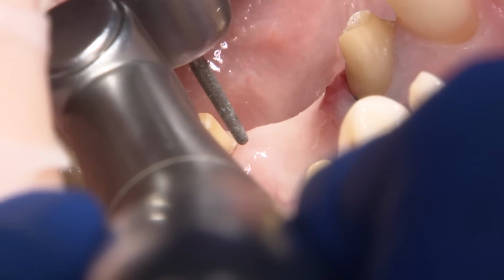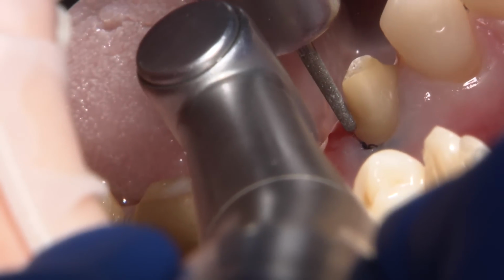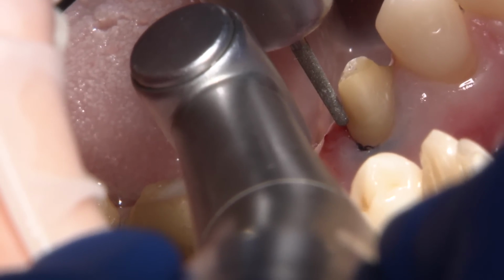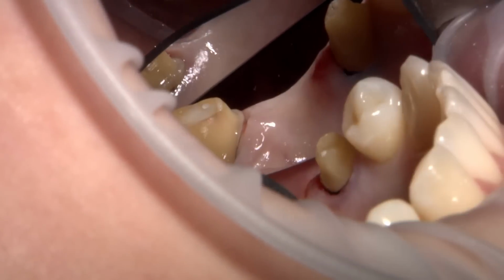Fortunately, there are other methods rather than eyeballing that can provide a better solution to the draw problems. At the end of this presentation, you will get to see how these methods can eliminate the possibility of another reprep appointment in case the preparations are not parallel enough to draw.